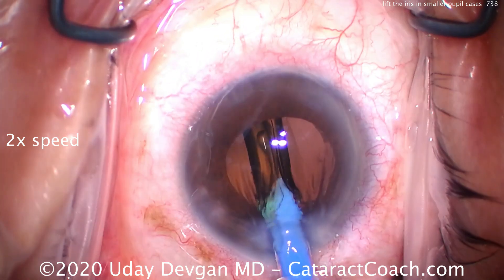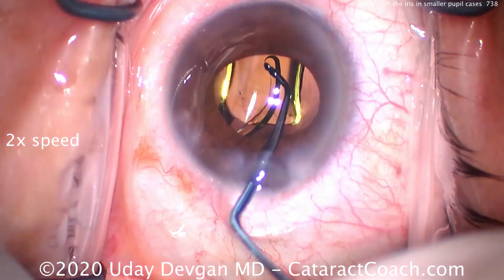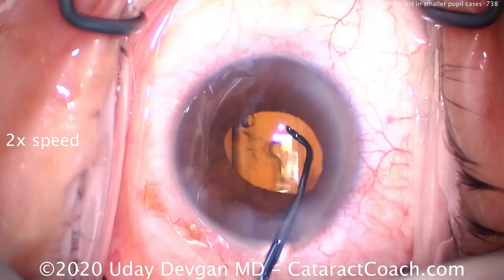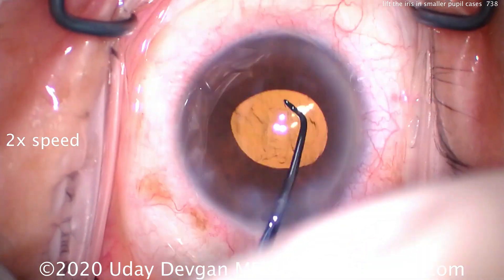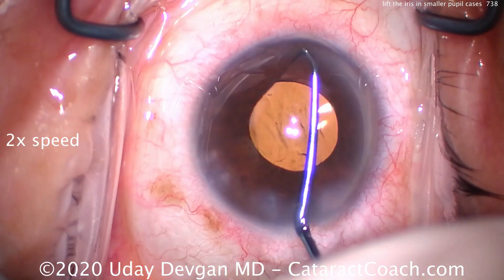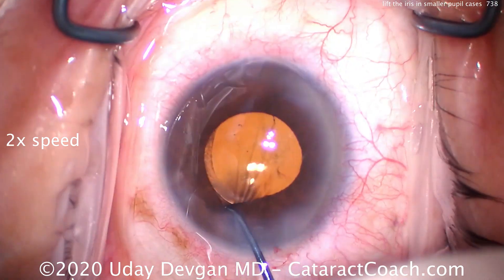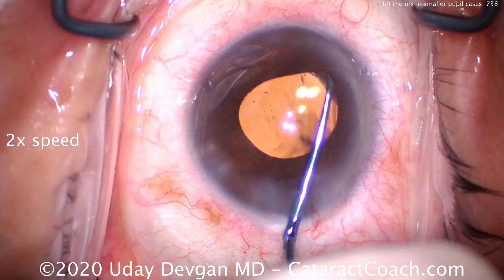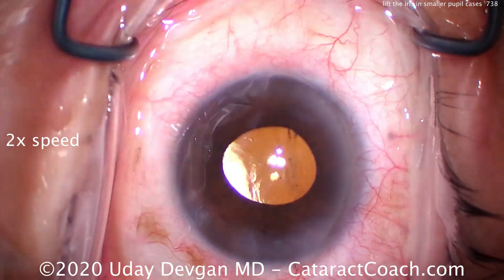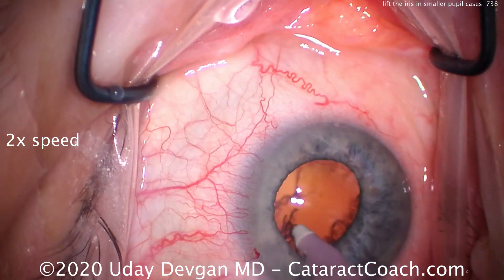Let's look at another one. Again, putting the IOL inside the capsular bag, shown at two times normal speed, just so we can show more cases. Opening up those haptics — in addition, we have to make sure that both haptics and the optic are completely within the capsular bag and behind the rhexis. Remember, if any part of this single piece acrylic lens is in the sulcus, it can cause a lot of problems such as UGH syndrome — uveitis-glaucoma-hyphema syndrome. And that's a problem.